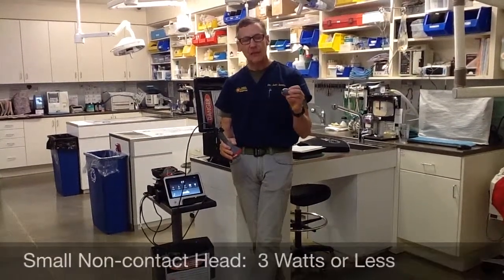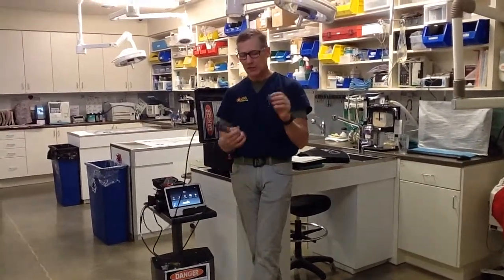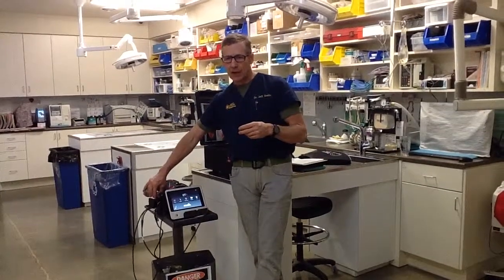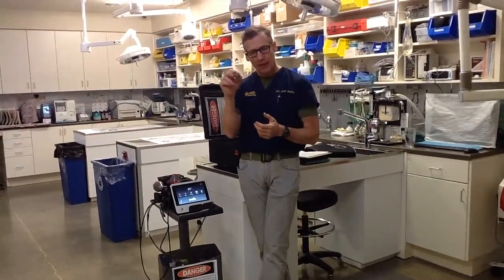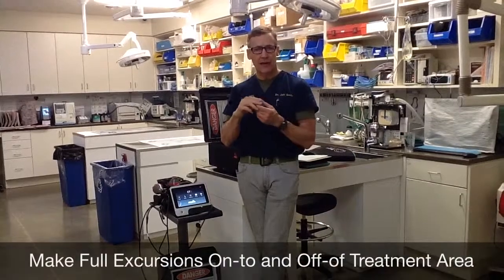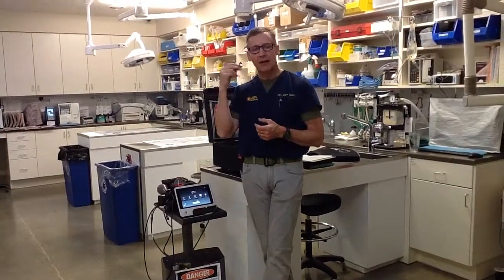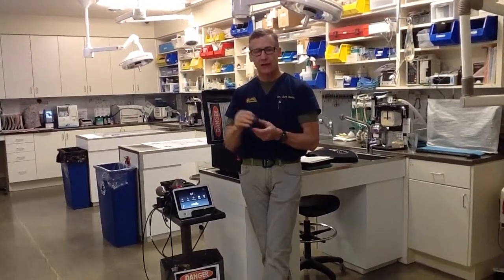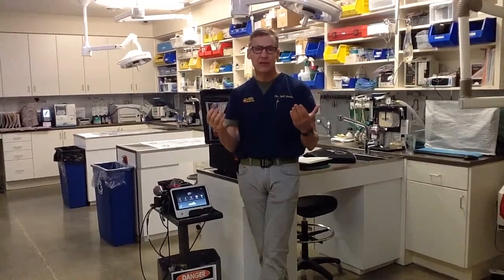The small non-contact head I use least frequently, and it should be used with three watts or less because it has the smallest focal spot — a lot of energy warms up the treatment area more quickly. A common mistake is to vibrate it in the same place. With cat ears in particular, people get very focused on the pathology and don't make a full excursion onto and off the pathologic tissue, so the cat starts to shake its head because the tissue never cools down. Make full excursions onto and off the area you're treating, and use it with less than three watts.